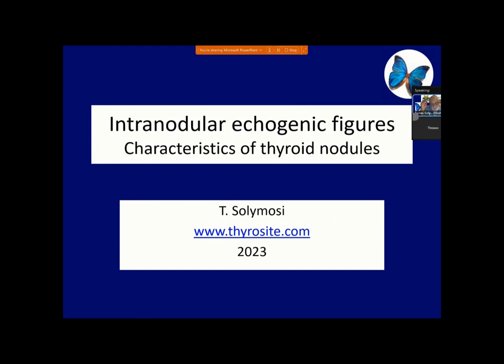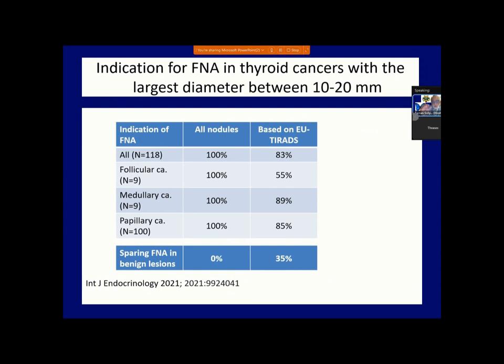In the upcoming four live webinars, we will discuss the ultrasound characteristics of thyroid nodules, except for nodule echogenicity and composition, which were the topics of the previous webinar 3 weeks ago. Before turning to the discussion of these features, it seems worthwhile to analyze the topics to be discussed from a slightly broader perspective. I ask you to use the lessons of this table to filter the things that will be said in the coming weeks. These lessons not only seem to be disturbing, but are really thought-provoking.